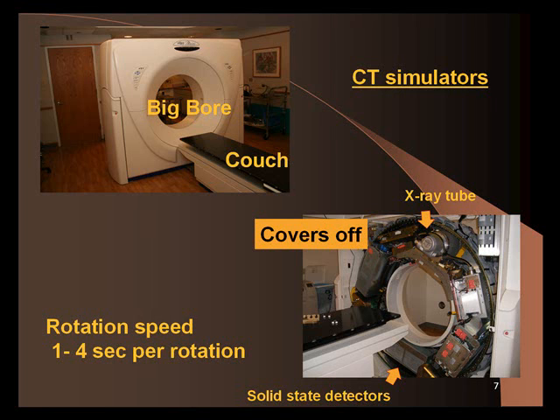And if the treatment planning computer doesn't know what's beyond this dotted line, it doesn't know how thick the patient is, so it'll misinterpret the depth of the photon.